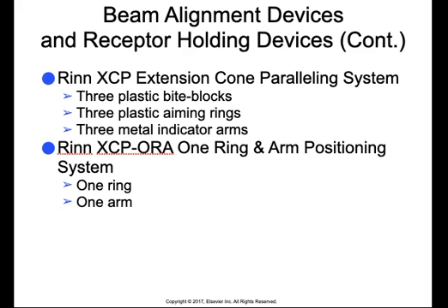Once again, the XCP-ORA is just a one ring, one arm type of device where you can just use one device. You just have to switch it around, and it comes in different configurations depending on which area in the mouth you're imaging.